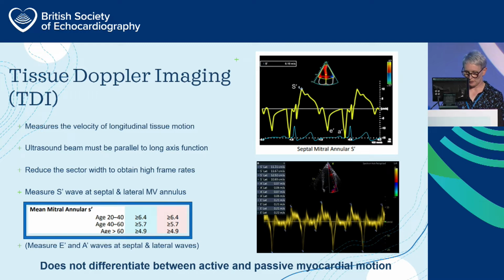And we're going to measure in this view the systolic or S wave. And we just need to take care not to mistake it for the isovolumic contraction, which is the first little deflection that you see. So make sure it's the second deflection that you see that you measure.